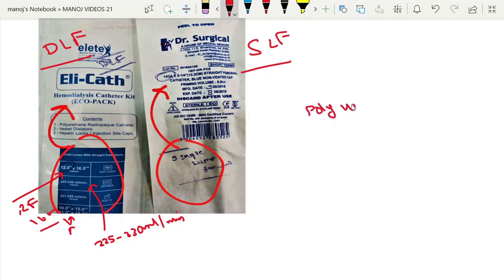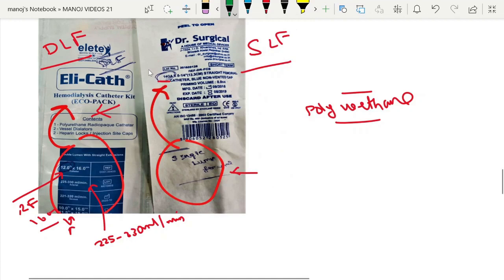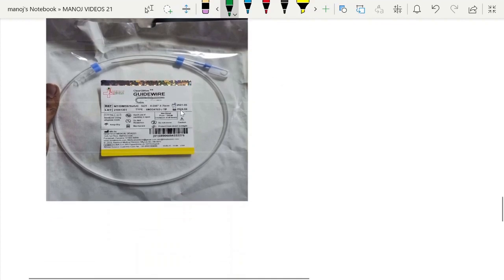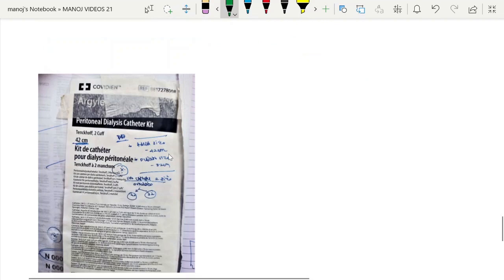Here single lumen catheter, it is being mentioned as gauge not the French gauge. So basically it is 2 mm outer diameter, so that means 6 French. It is about half of this double lumen catheter. This one is the single lumen catheter. The guide wire commonly used is J tip guide wire, the length is 70 centimeter, commonly being used for placing these catheters.